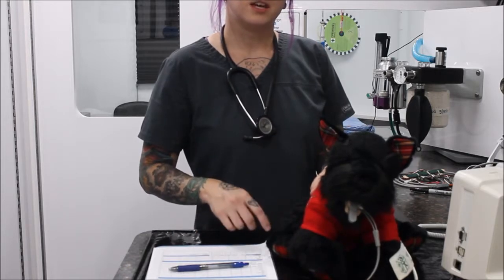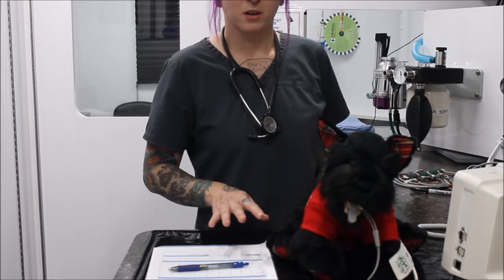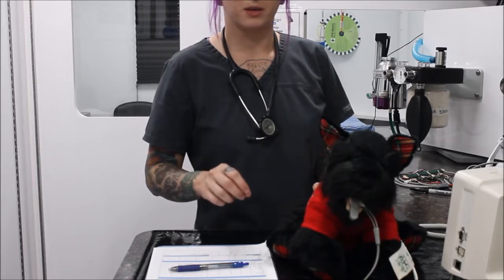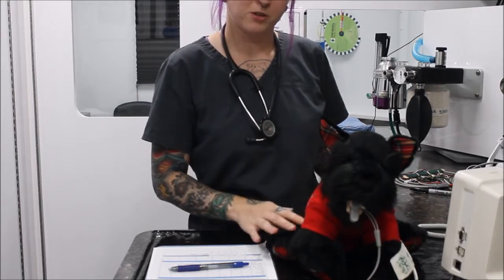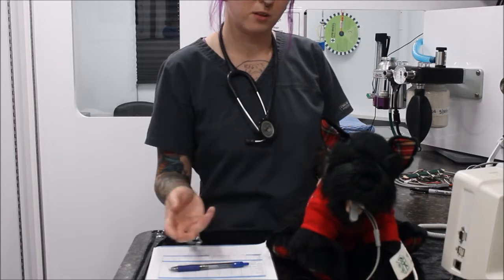And then you've got stage 3, plane 3, which is usually a deeper anesthetic plane. Usually the heart rate will decrease a little bit, and the breath will become a little more shallow. At that point, you should probably monitor your patient and either turn them down or figure out what to do, and tell the doctor.